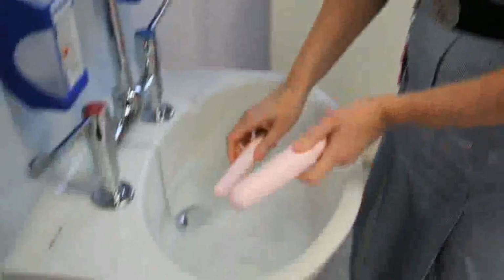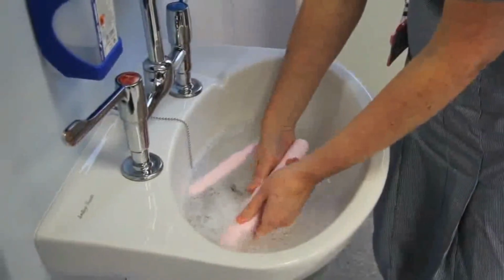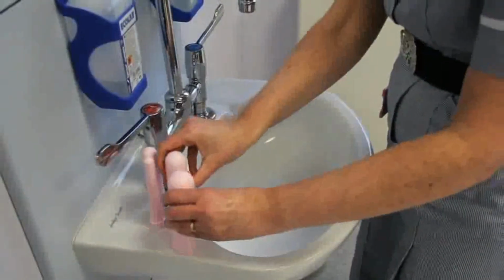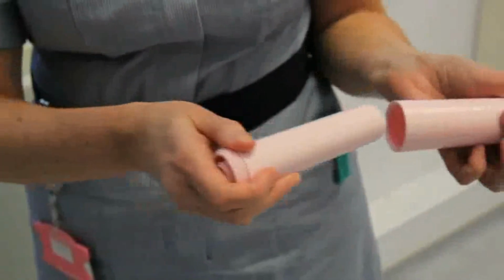To clean your vaginal dilators after each use, they need to be washed in warm soapy water and then dried thoroughly, and then they can be stacked inside each other for storage. You will be advised how often to use the dilators by your health professional, and the dilators can also be used in conjunction with having intercourse.